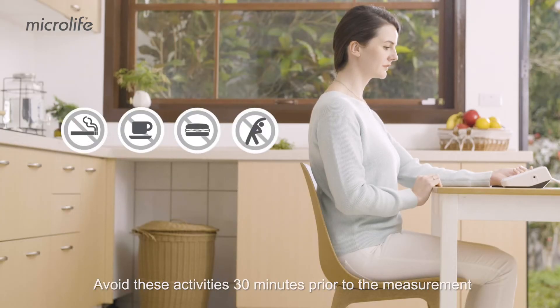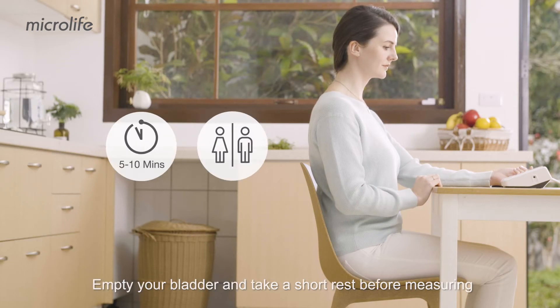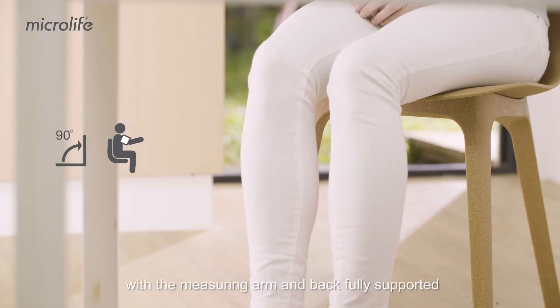Avoid these activities 30 minutes prior to the measurement. Empty your bladder and take a short rest before measuring. Sit up straight, legs uncrossed, feet flat on the floor, with the measuring arm and back fully supported.